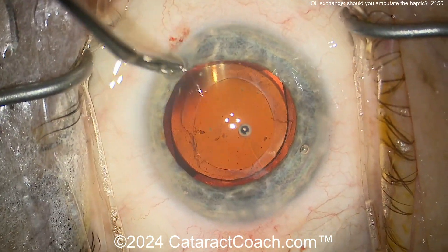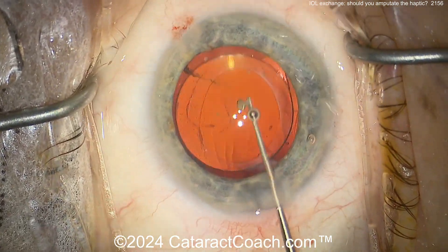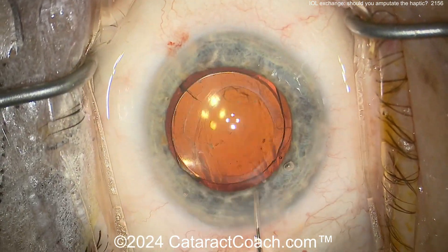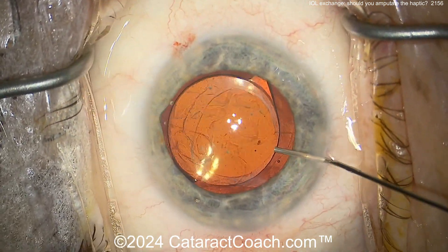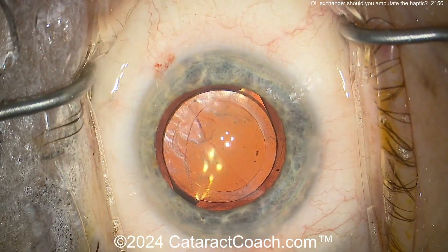Now here's the new lens already in the capsular bag — that looks fantastic. There's that one extra haptic. Leave it alone. Notice how the surgeon ensured that the new IOL haptics are not interfering with or touching the remaining amputated haptic — that's an important point.